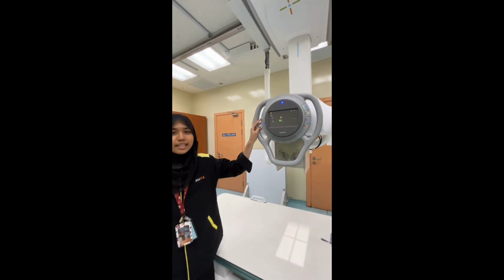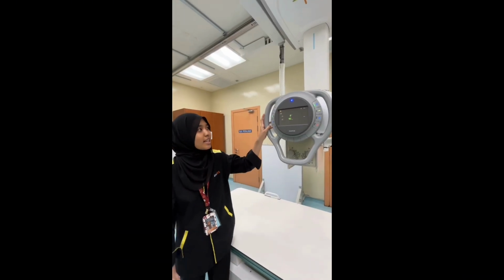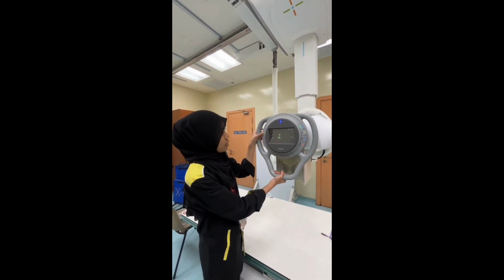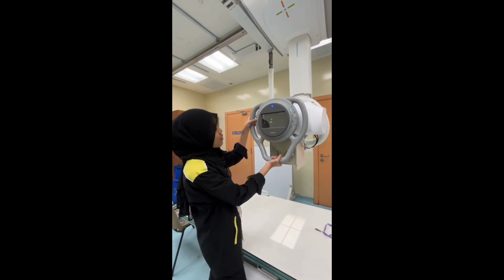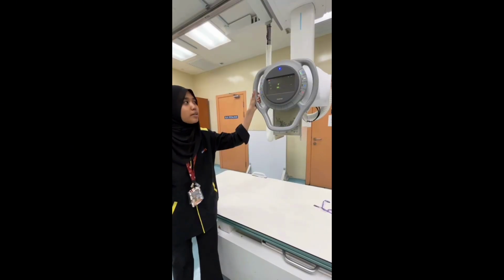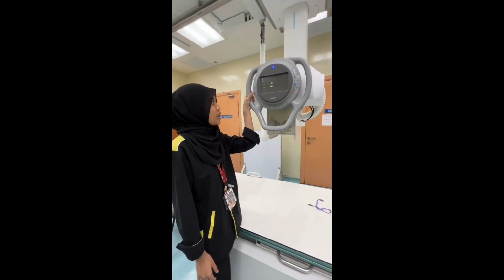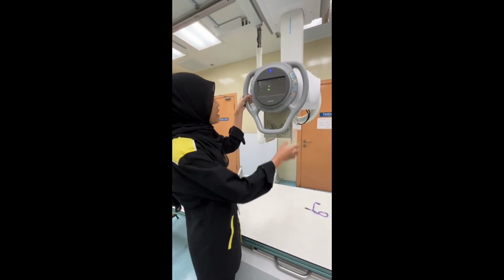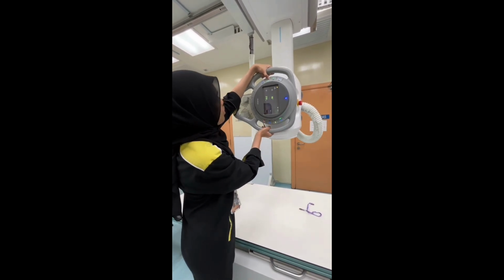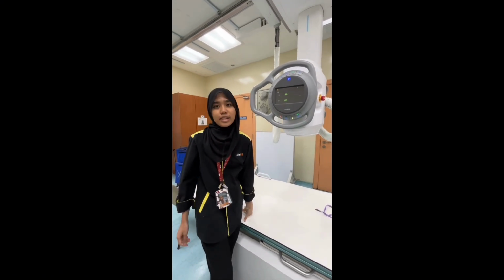For this button, we can only go up and down. So as you can see, when we go up and down, the distance will change. For the third button, we can do the angulation, either 90 degrees or something else. For 90 degrees, we used to do a chest X-ray.